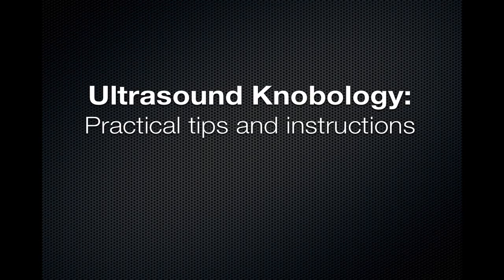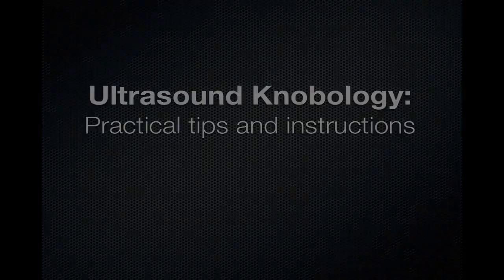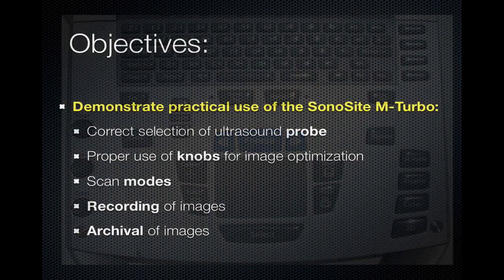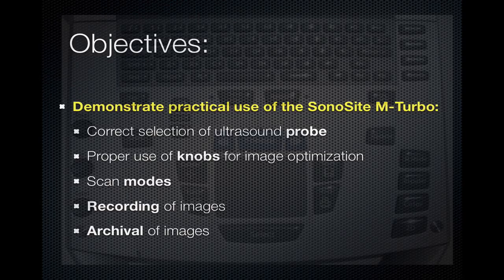Ultrasound Knobology: Practical Tips and Instructions. This is the keypad of a Sonosite M-Turbo. Depending on the year of manufacture, the buttons may be located in different positions, but the functionality remains the same. The objectives of this talk are to demonstrate practical use of the Sonosite M-Turbo, including correct selection of ultrasound probe, proper use of knobs for image optimization, describing scan modes, how to record images, and archival of images.